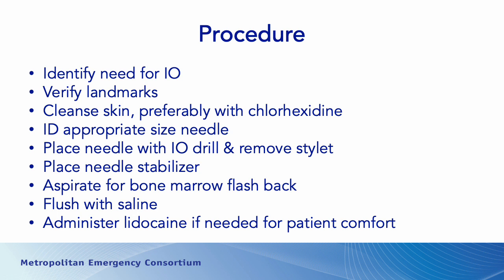Verify your landmarks. Determine where you're going to put it. You're going to put it in the shoulder. You're going to put it in the tibia. Verify your landmarks. We'll talk about that a little bit. Clean the skin. A lot of times we'll just grab an alcohol wipe, but preferably clean the skin with chlorhexidine. I know some agencies carry chlorhexidine wipes in their trucks, but chlorhexidine is a better skin prep for this than alcohol. If an alcohol wipe is all you have, use it.